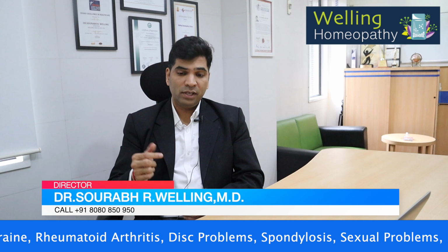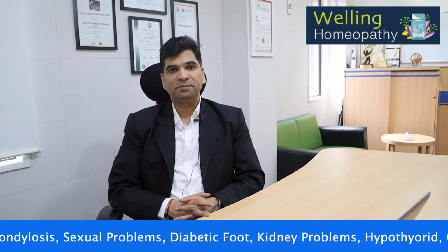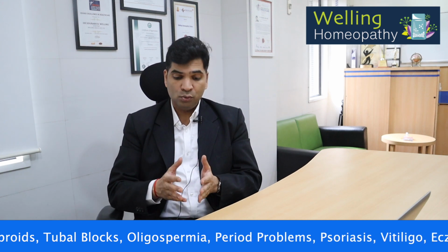Begin using the test about 2 days before you expect to ovulate. If you are not sure when you will ovulate, you can use the usual ovulation calculator or a chart. Now, there are various fertility apps that can help you estimate when your ovulation is likely to occur. You can also talk to our specialist to make the calculations for you.